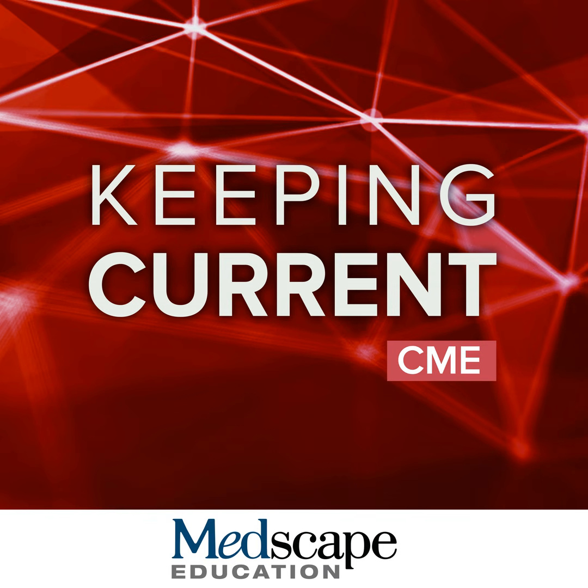And again, this is why the interpretation of the Centiloid, if it's between 10 and 30, absolutely has to be in the context of that visual read. And we're hoping that the report that you get back, or that if you're a nuclear medicine physician that you're giving, will accurately explain the findings, particularly in this gray zone. Okay, so what do we say to our patients when we get that amyloid PET result? Obviously, we're going to be talking about that, but it needs to be related to the clinical diagnosis.